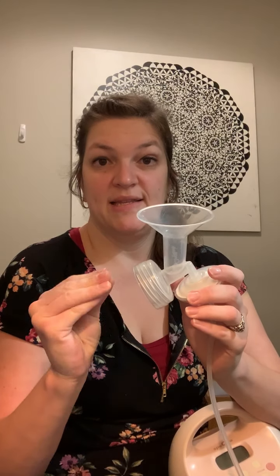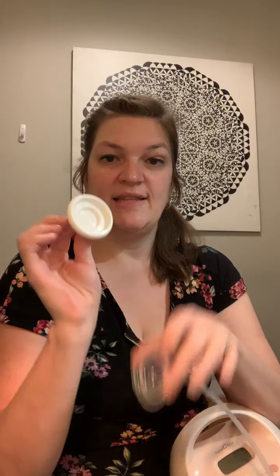It does have the duckbill membranes, the little white pieces that have the slit that act as a flap, so that they are good. This is also a closed system, so because it has this diaphragm, your milk won't get into the tubing. It's a backflow protector, protecting your milk from getting into the pump. So you could theoretically give this pump to someone else, or someone else could use this pump and just buy new soft pieces and tubing. This milk protector attaches to the back of your pieces.